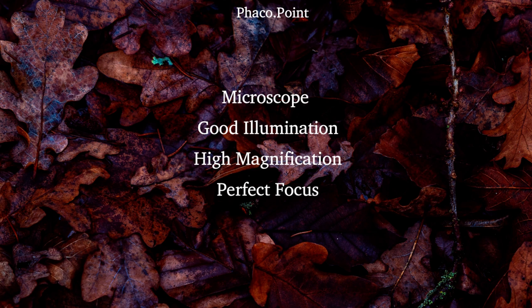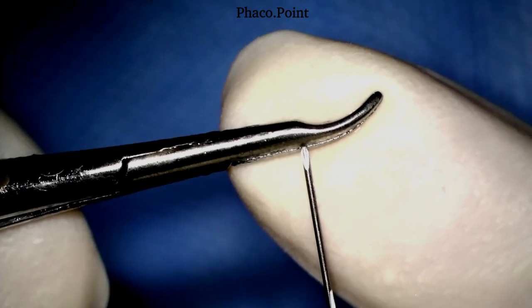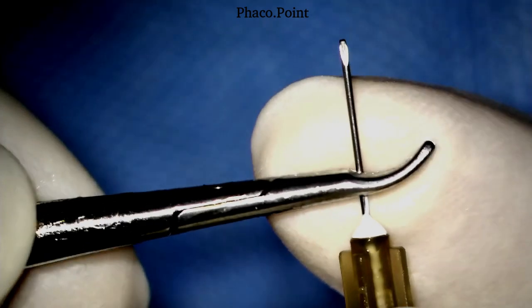We need to understand that the perfect cystitome is one wherein the bend is no more than one-third or one-fourth of the bevel. The needle holder is taken into position so as to achieve the perfect bend. Having achieved the perfect position, the ends of the needle holder are now opposed over the tip of the 26-gauge needle and in one turn — maintaining the bevel outwards — is turned so as to fashion a tip at right angles to the shaft of the needle. Having created the cystitome tip, we now move to creating the proximal bend at the junction of the hub and the needle itself.